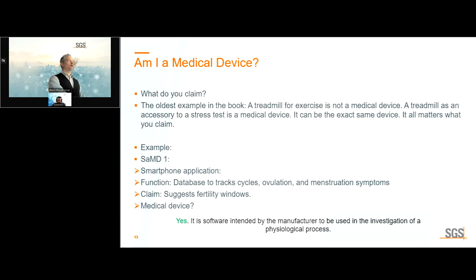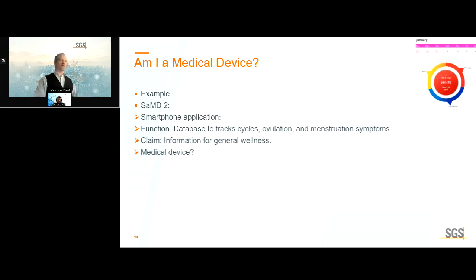Great. Now let's take the exact same medical device. Absolutely nothing has changed. It is going to track the exact same thing in the exact same way on the exact same phone. It now makes a claim: information for general wellness. So now I'm going to ask you the same question. Is this a medical device? Again, yes, this is a medical device, or no, this isn't. Nothing's changed. Same exact device, different claim.